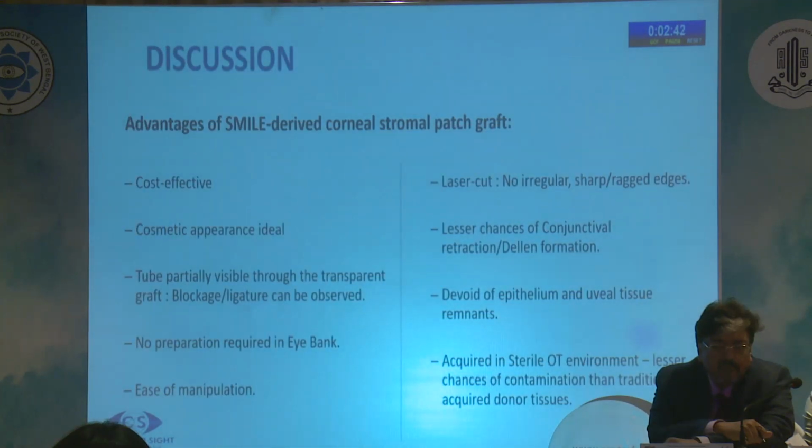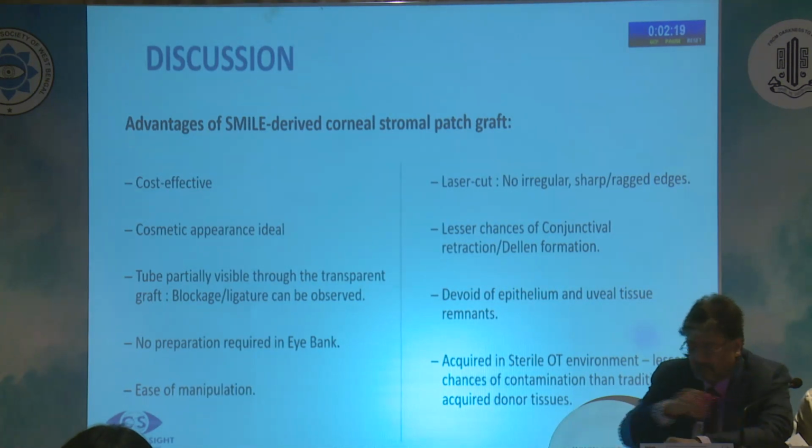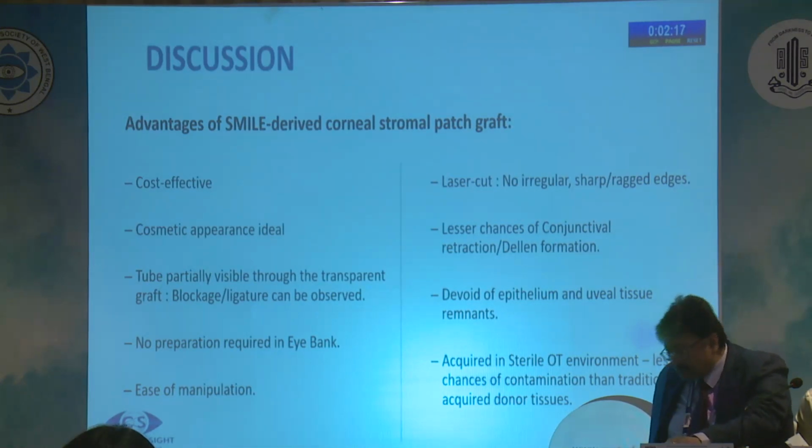The advantages of SMILE-derived corneal stromal patch grafts are: it is cost-effective, the cosmetic appearance seems to be ideal, and the tube is partially visible through the transparent graft, so blockage or ligatures can be observed. There is no special preparation required in the eye bank. There is ease of manipulation of the tissue.